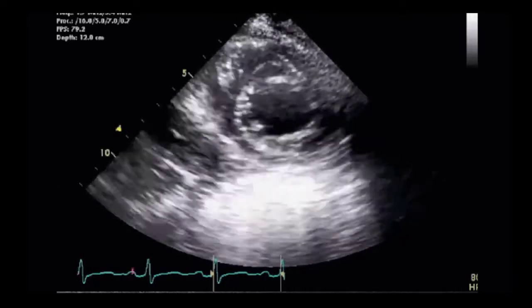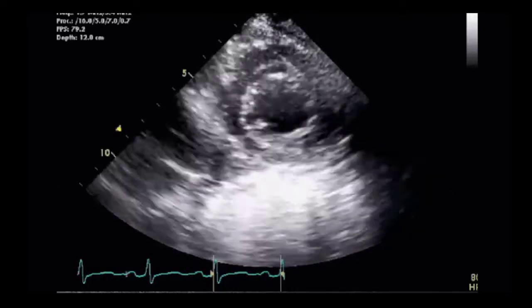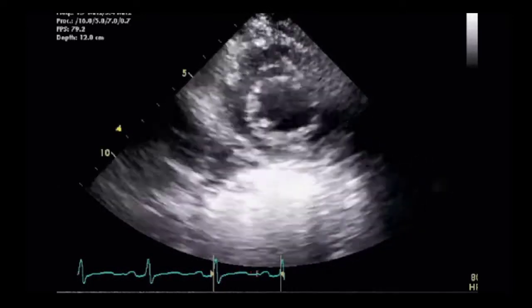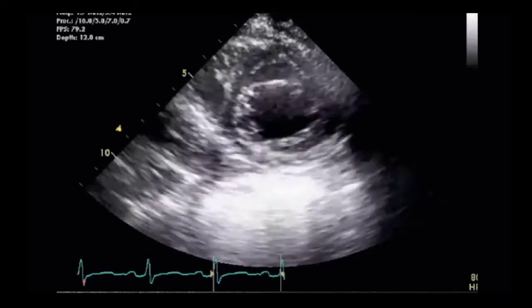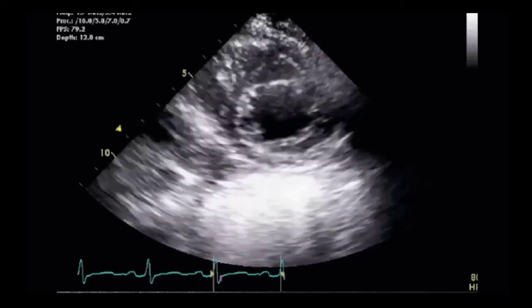This is an example of a patient with hypovolemia. The LV cavity appears empty in systole, with the walls almost obliterating the cavity during systole. The LV end diastolic size is also reduced in hypovolemia.